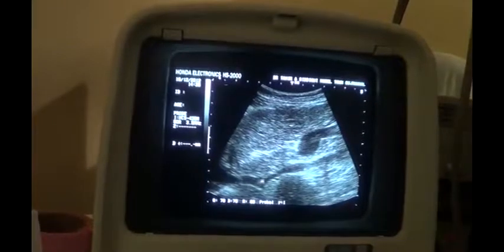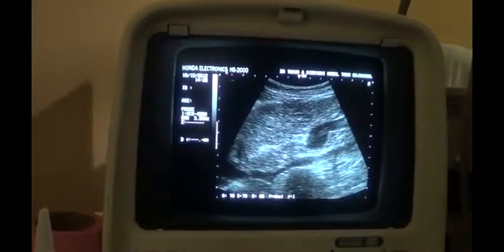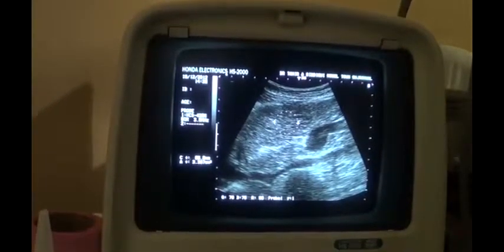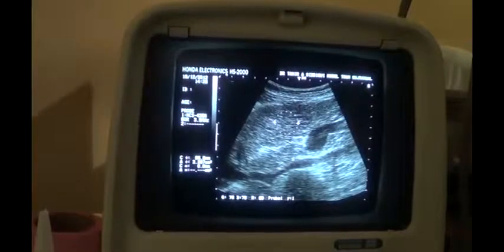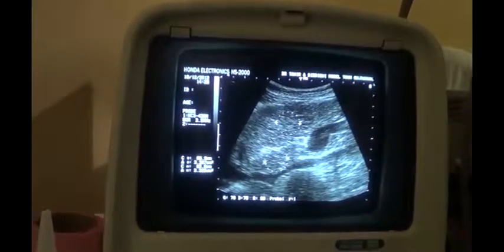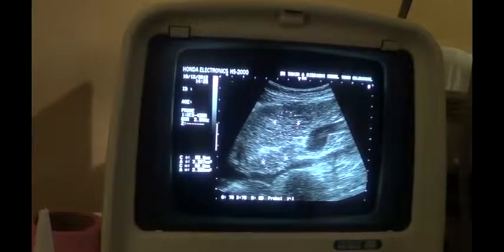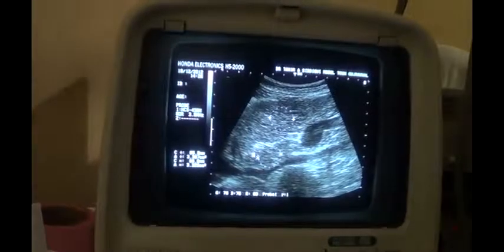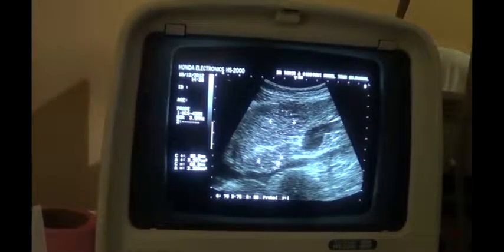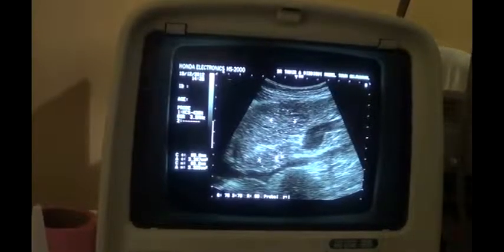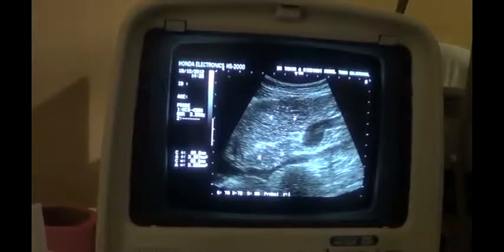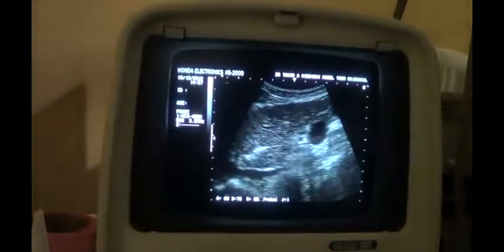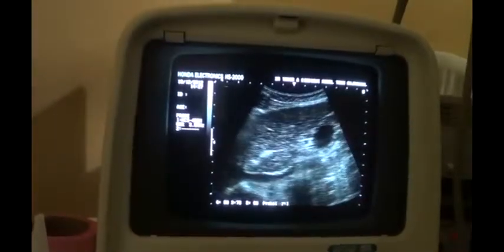This is the caudate lobe of the liver. This is the inferior vena cava. If we compare the echogenicity of the caudate lobe — this is the caudate lobe or segment one of the liver — they are almost the same. Whereas in most cases, in 90% of the cases, you will see that the echogenicity of the caudate lobe or segment one will be preserved because this segment of the liver contains its own separate blood supply.